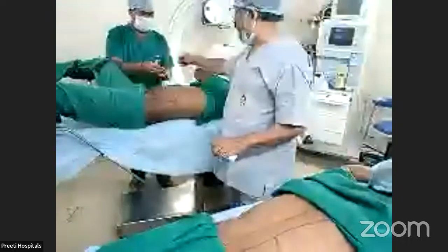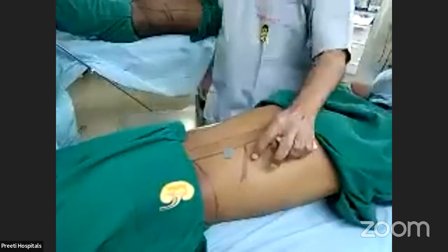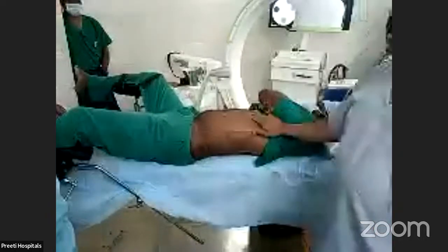So I wanted to ask a primary question. There are clinical scenarios we discuss. Imagine this coin is present in the pelvis, like this. It has access to the upper pole, the middle pole, and the lower pole, with the ureteric catheter kept. You are having a pelvic stone here. In this case, what will you prefer and why?